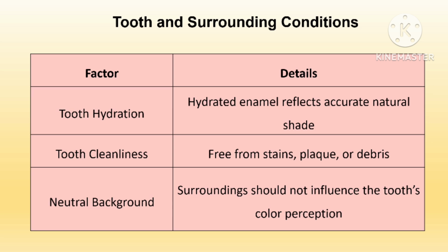Finally, control the surrounding colors. Bright clothing or bold lipsticks can reflect onto the tooth, altering the perception. To neutralize this, drape the patient with a gray bib or use a neutral colored background.